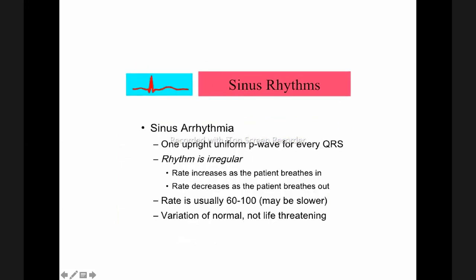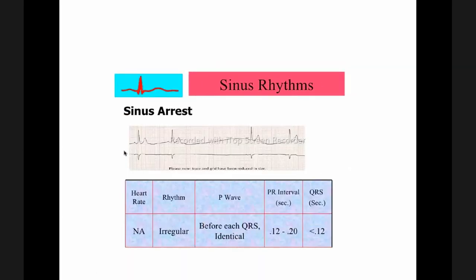The next bradycardia I want to talk about is this one. So this one is also a lead two. But look at it step by step, very simply. Start from here. Are we in sinus rhythm? There is a P. Then next is a QRS and a T wave. Okay. Next there is a P, then a QRS, then a T wave. Then all of a sudden, where you expect to see a P, there is nothing.